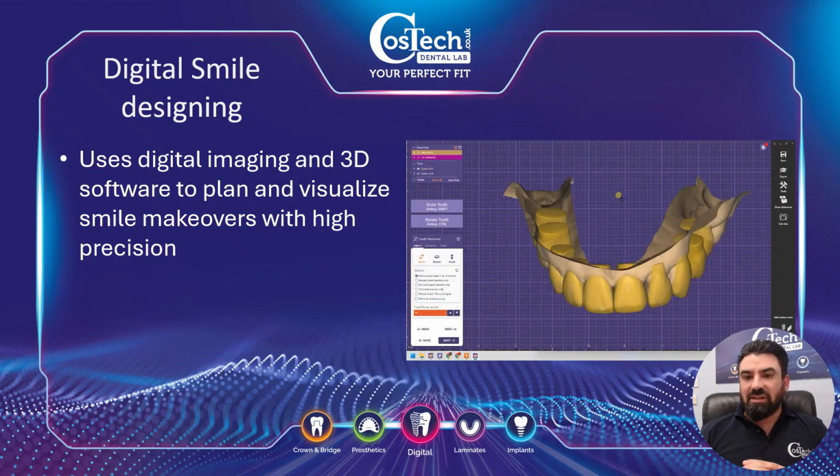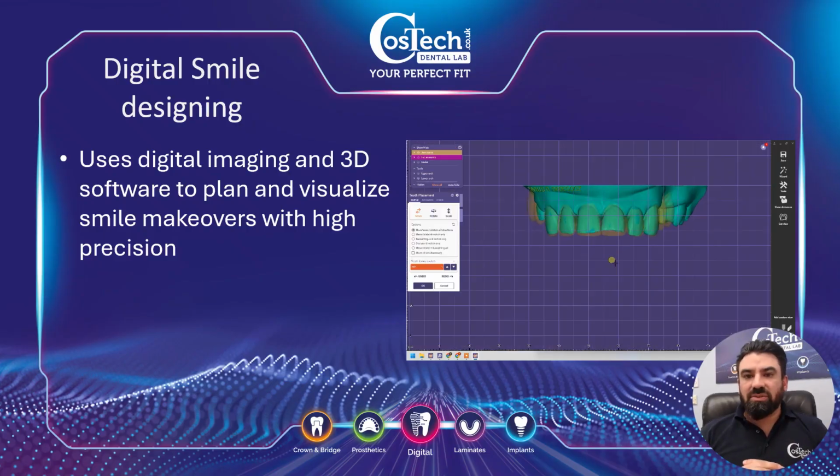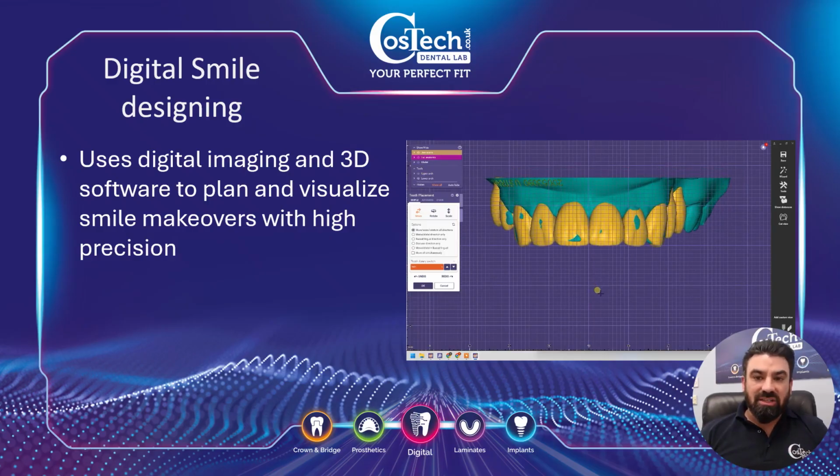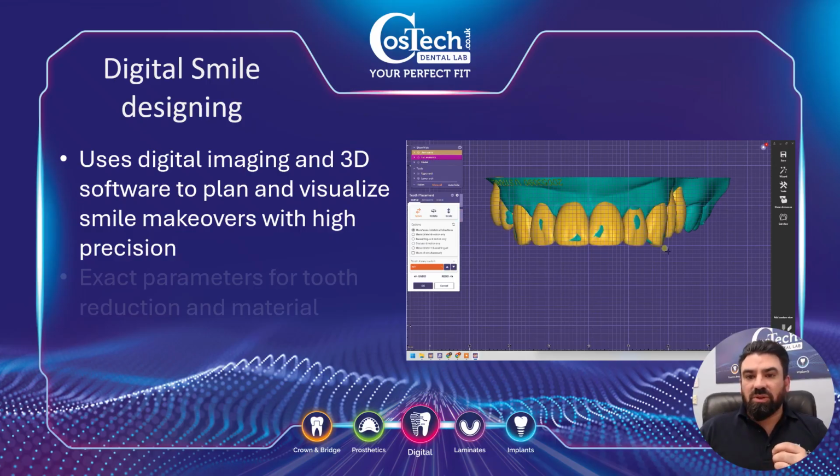And then we look at, okay, is anything compromised on the functionality side? How can we enhance the functionality? If we need to raise the OVD and you tell us, okay, raise the bite by 2 mils, right, let's do that first. And then we can actually go through various different scenarios before actually coming collaboratively to one design.